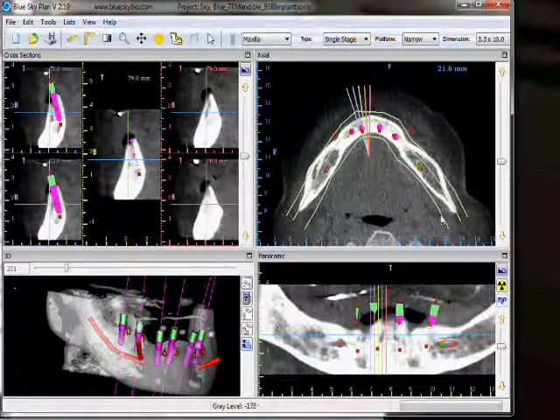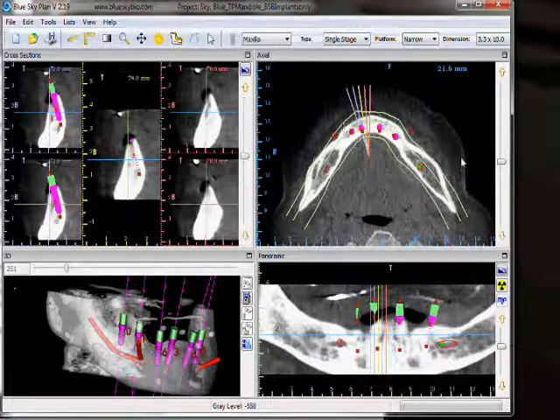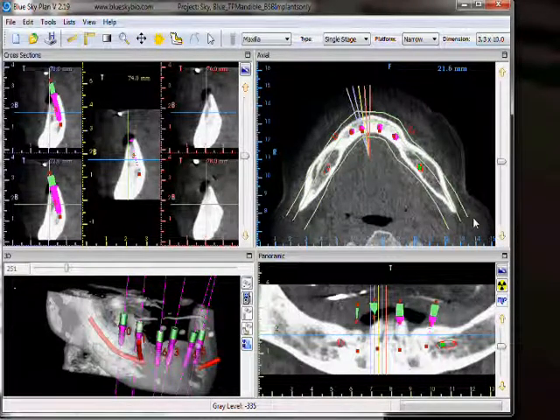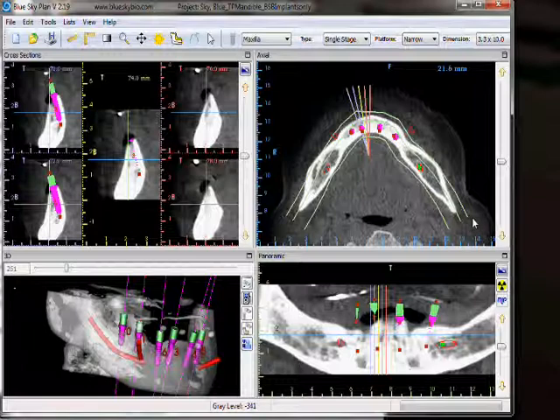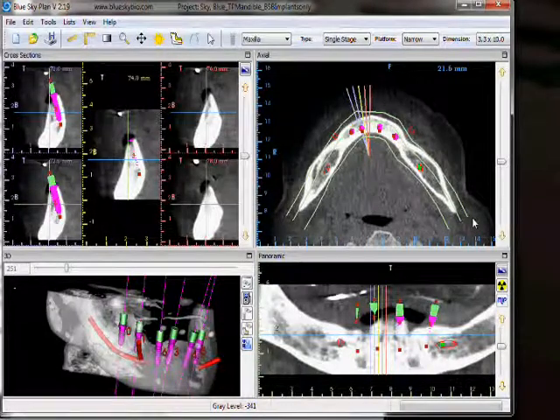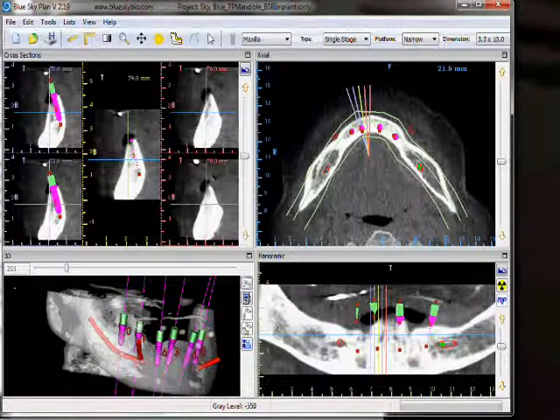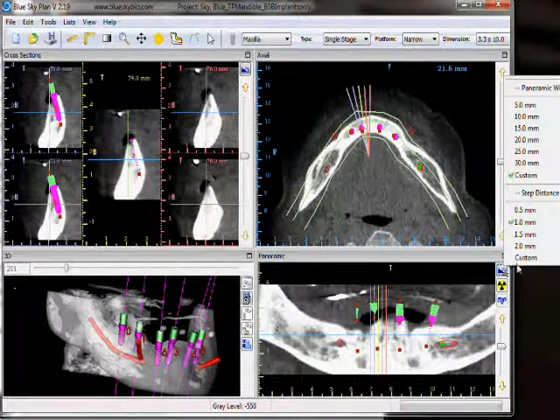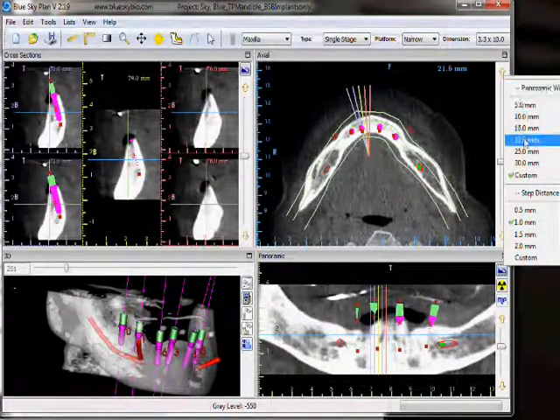The inner and the outer panoramic curves in our axial view indicate the inner and outer limits of our field of view. We are able to change the field of view by clicking on the top right icon once again and changing our panoramic width.